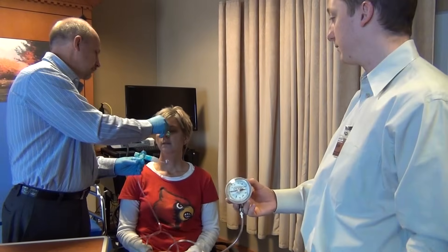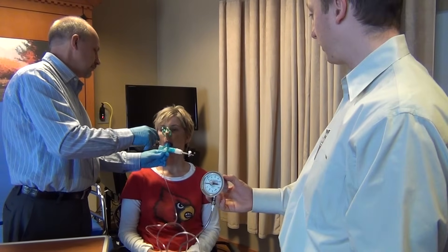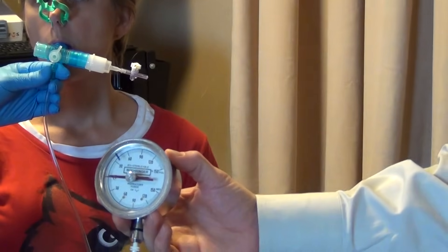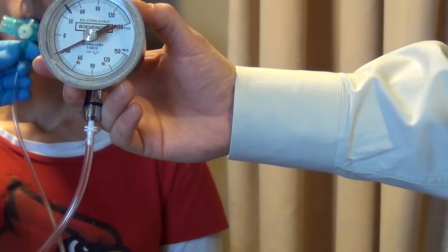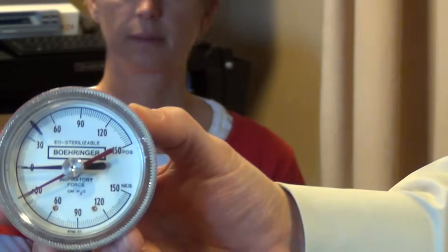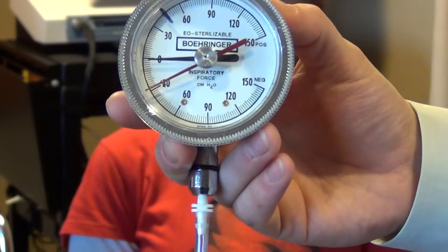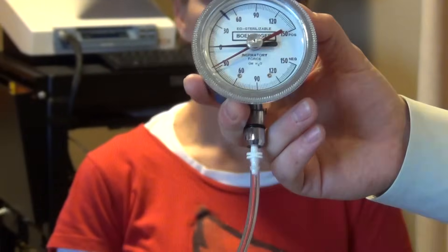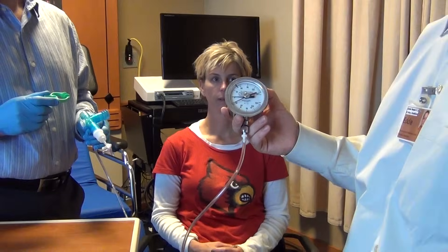We put the nose clip on. Bite down. Take a little bit of air into your lungs first. Now blow out through the mouthpiece. Now in. And stop. Now you can see the red reference needle showing the amount of pressure generated on that attempt.